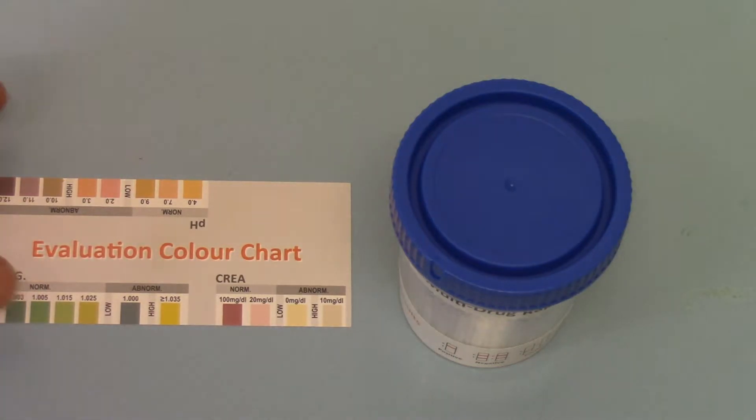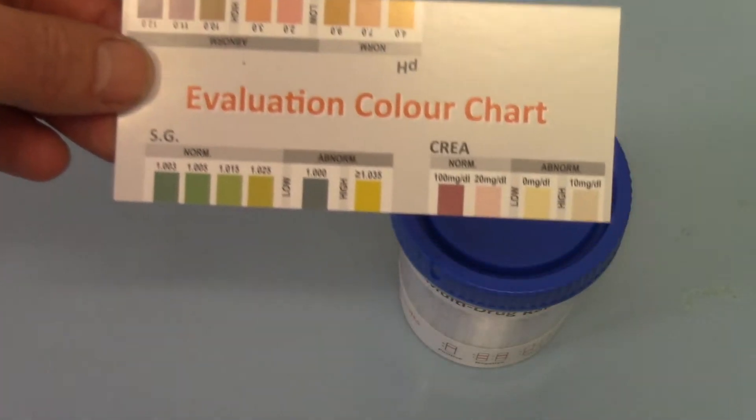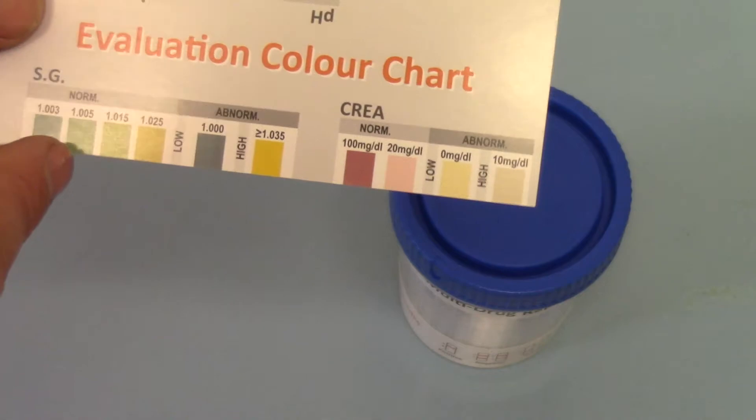With the cups you've been supplied with, you'll get one of these evaluation color chart cards. They have different readings for different parameters on here.